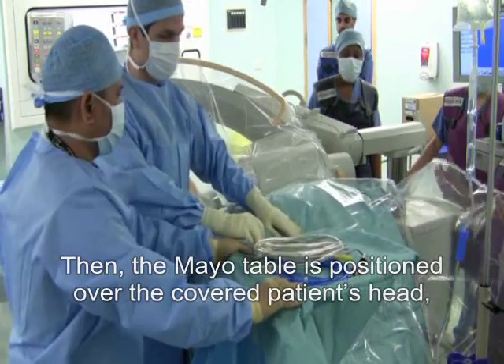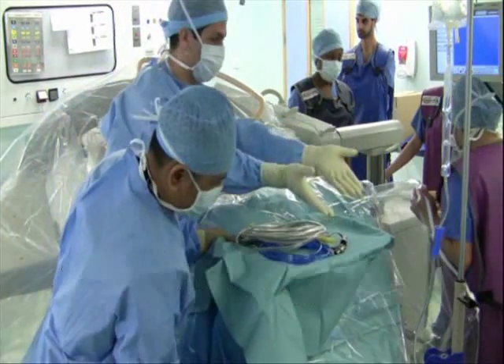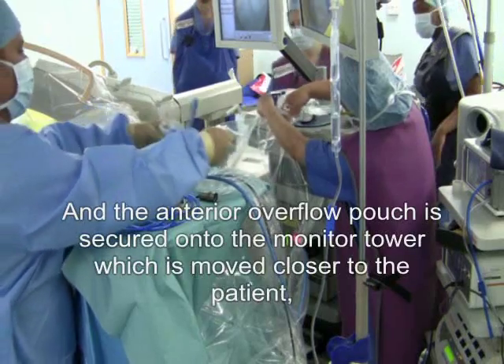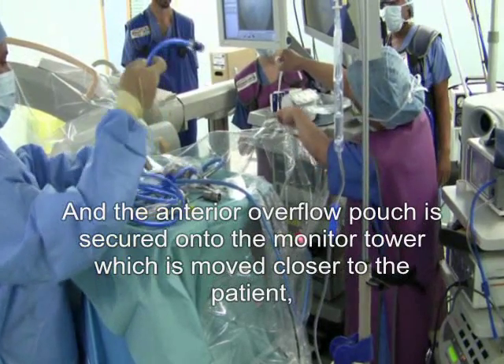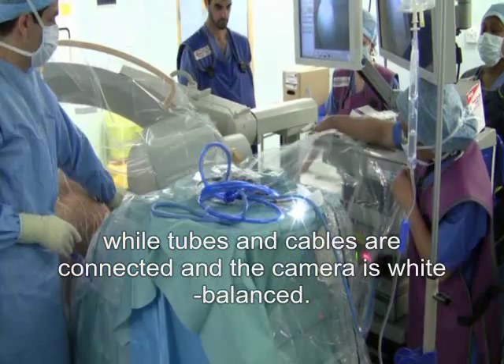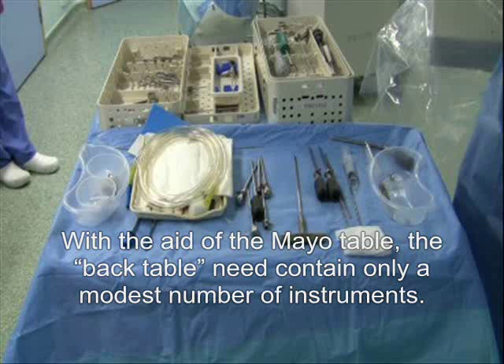The Mayo table is positioned over the covered patient's head, and all tubes are positioned so that they reach the operating field from the side of the Mayo table only. The anterior overflow pouch is secured onto the monitor tower, which is moved closer to the patient, while tubes and cables are connected and the camera is white balanced. With the aid of the Mayo table, the back table need contain only a modest number of instruments.